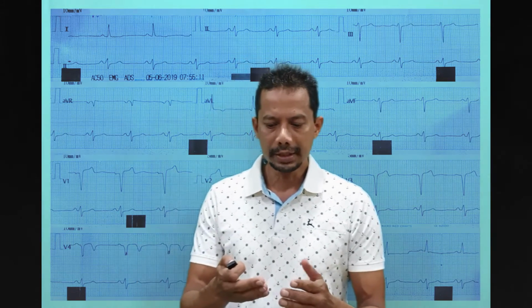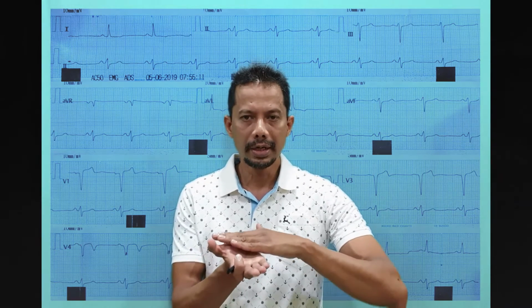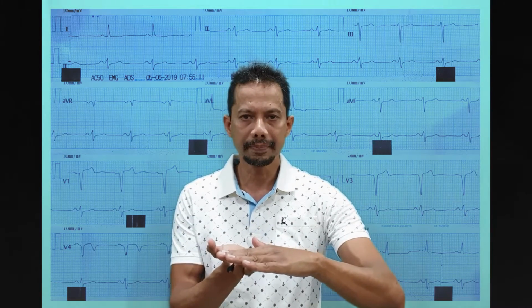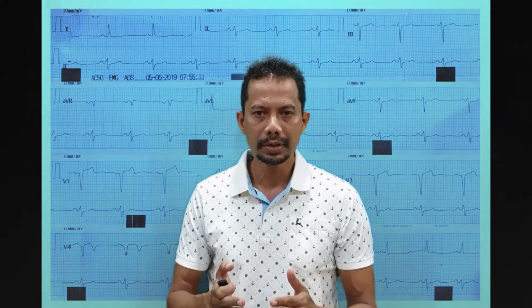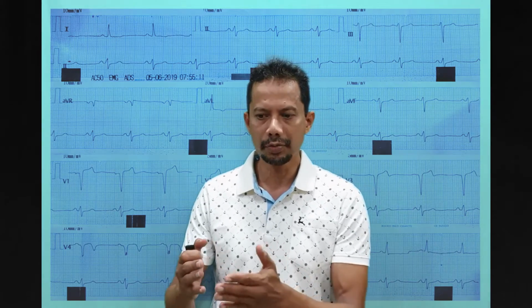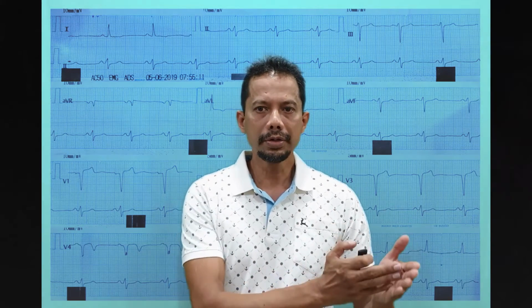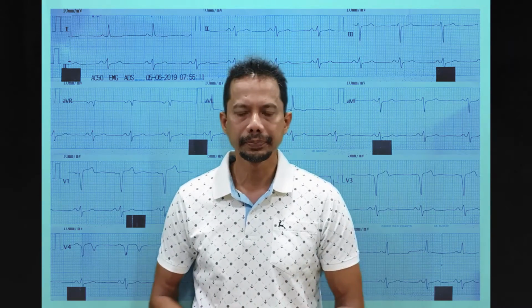Now, as you know, there are 6 anterior chest leads. They look at the heart in the horizontal plane, and in this video we will discuss all about the transition zones, conditions in which the transition zone will move beyond V4 or before V3.